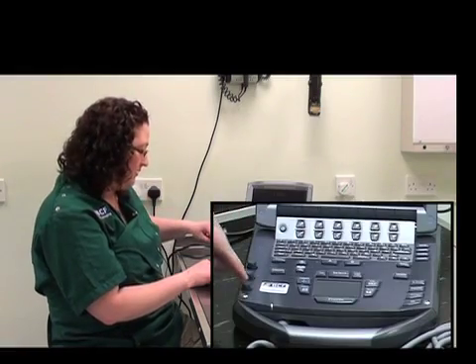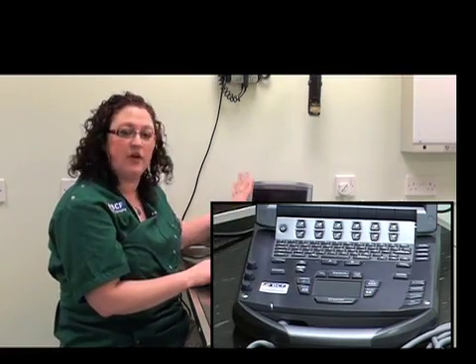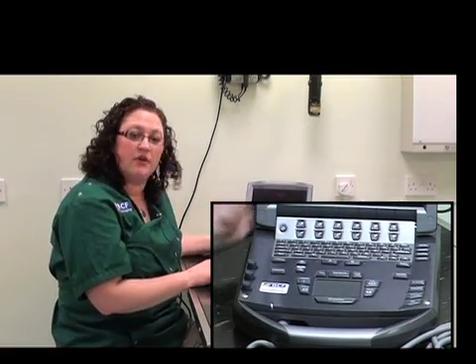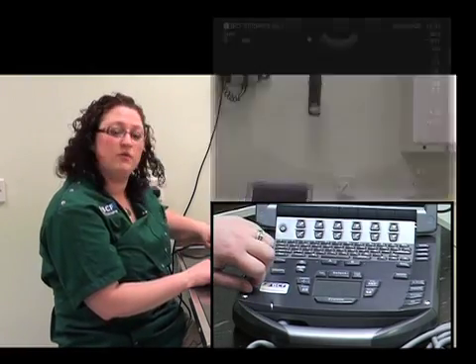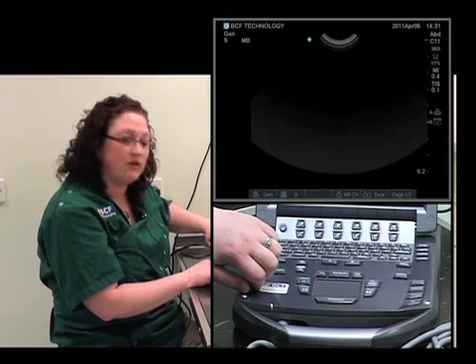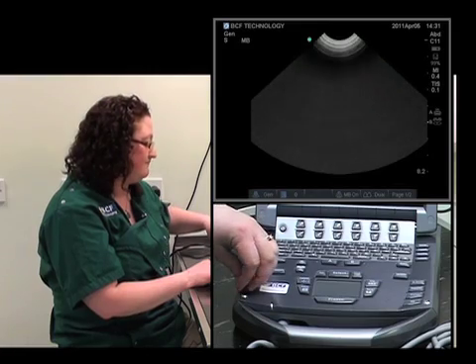It's also important to know where the overall gain button is. On this machine, it's located as a pop-up button. What the overall gain button does is increase the overall brightness of the image displayed on the screen, regardless of the depth. It's important to use this button very sparingly, as having the image either too dark or too bright can actually lead to misinterpretation of what's displayed on the screen.